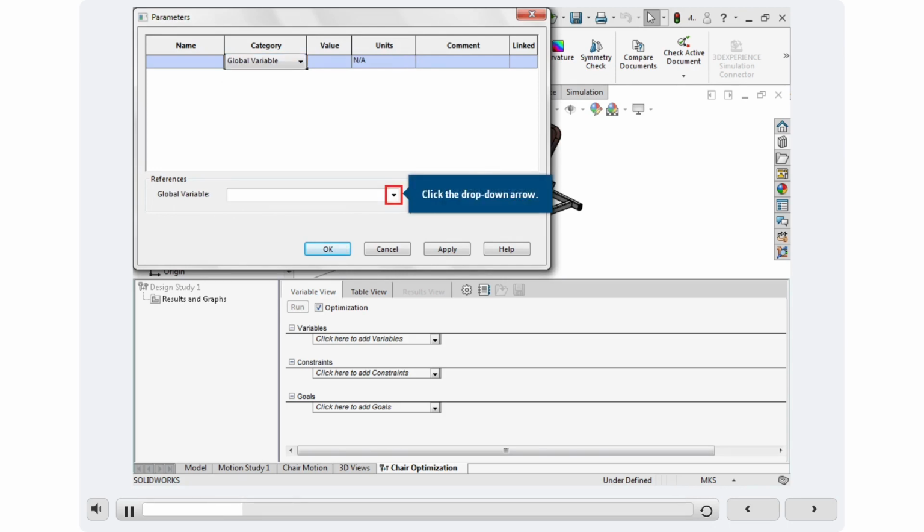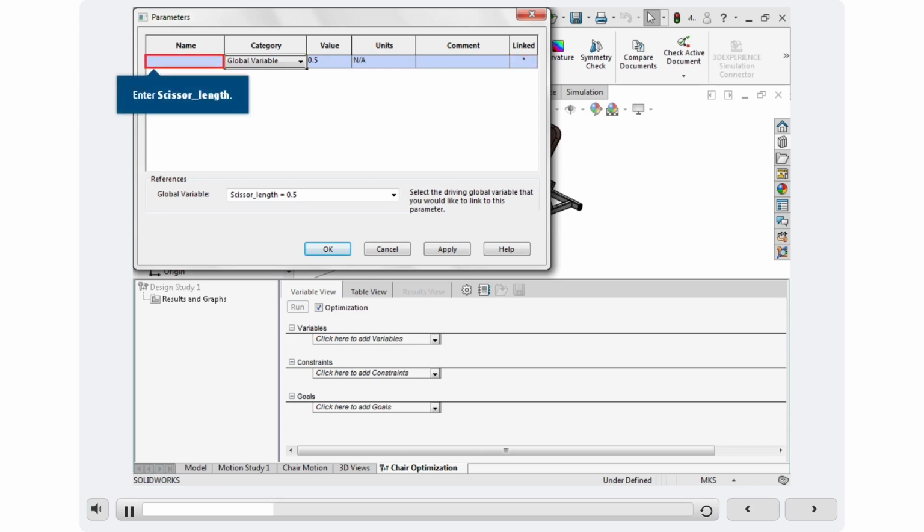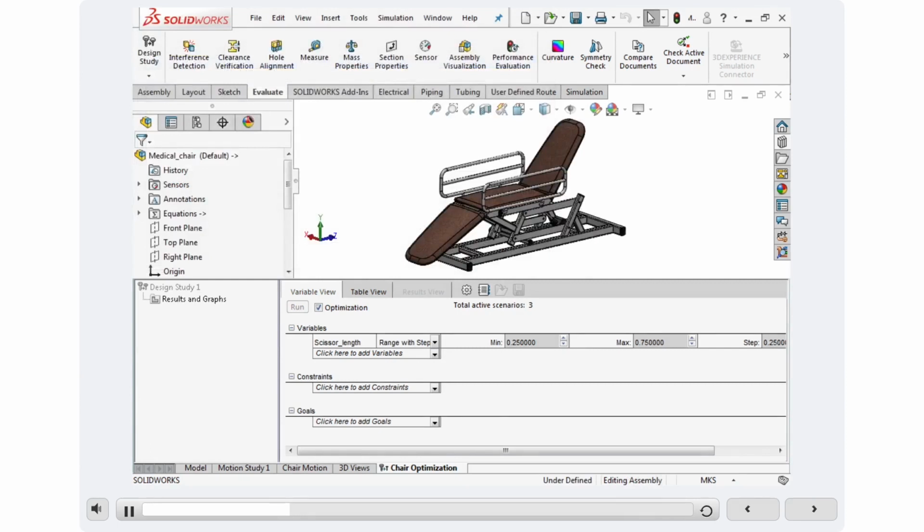Under References, click the drop-down arrow and click Scissor Length equals 0.5 as the global variable. The Value field displays 0.5 automatically, and the Linked field shows the star symbol indicating that it is tied to a model dimension or equation. Enter Scissor Length as the name. Apply the changes and close the dialog. Under Variables, click the drop-down arrow and click Range. Enter the value 0.4 as the minimum of the range. And enter 0.6 as the maximum of the range.